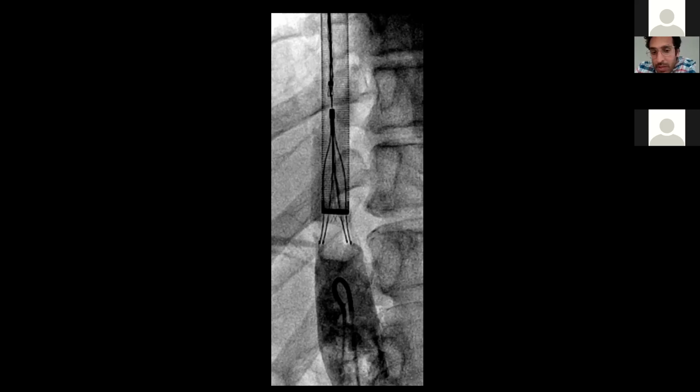So this was in the EP lab where they don't have DSA, unfortunately. But this is where we snare the filter and it's trying to sheath over it. This is with the 26 dry seal. And you can see the clot starting to pooch out. So I always ask people when I show this lecture, what would you do here? Would you stop? Would you go for it? Would you do something else?